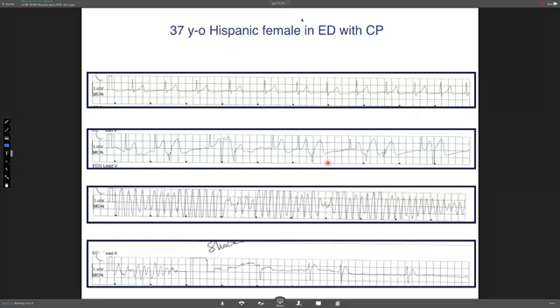This is my part. Khalid, Yousef, any comments or any questions? Very interesting case. Fathi, I had a similar case like this before, and we were debating. It's outside the scope of this presentation whether the patient needs an ICD or not. But how did you manage this patient? So, is calcium channel blocker... You think calcium channel blocker would be enough? No.